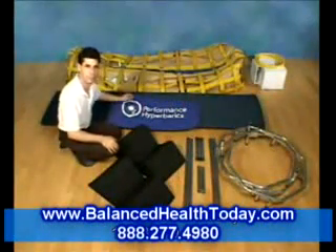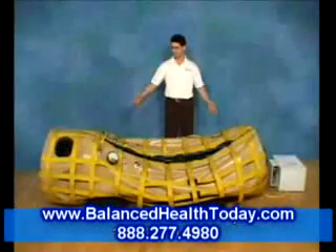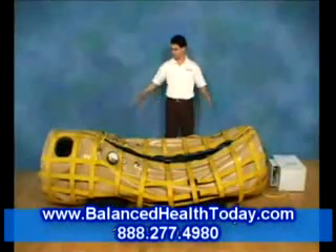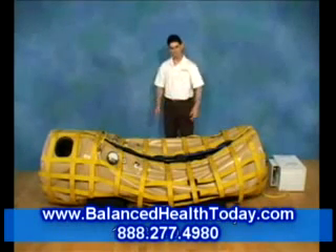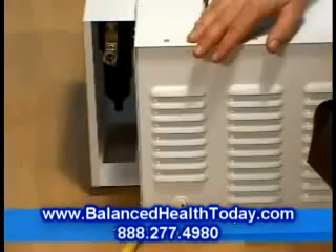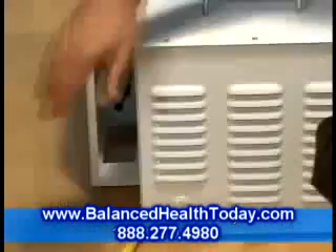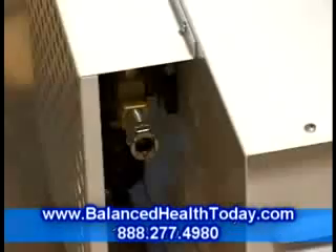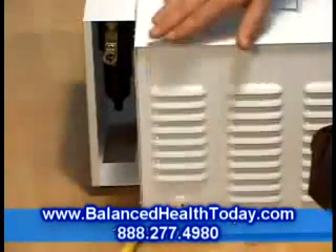Additional accessories, like this chamber cover, are also available. The chamber can be placed anywhere in your home or office where you have a space about 9 feet long and 3 feet wide. A standard household electric outlet should be nearby. Plug the compressor in and turn it on with this switch. You should feel air blowing out here. Now you can turn the compressor off.